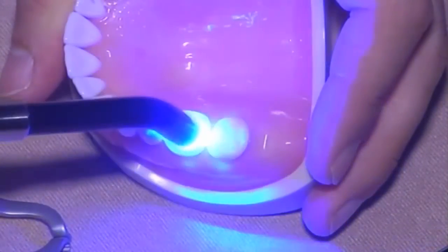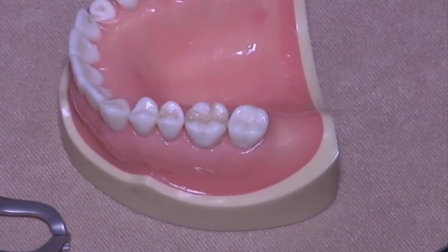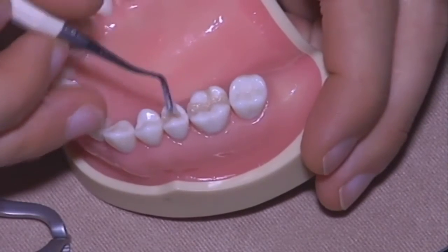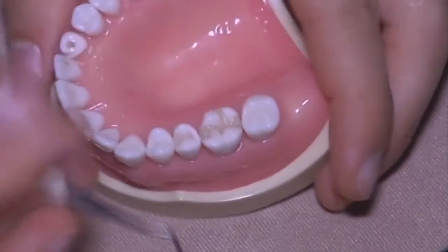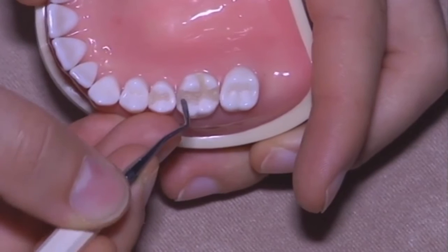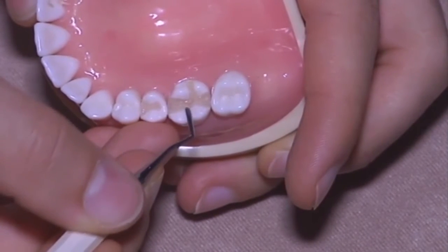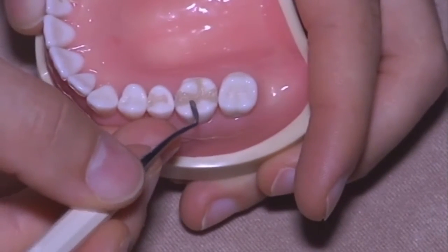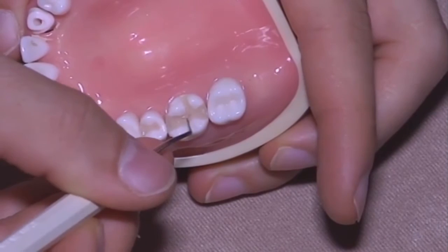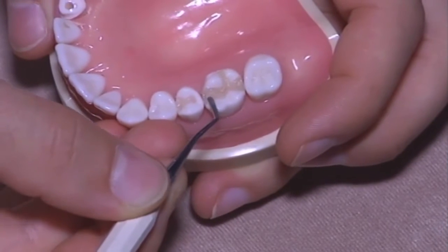That's it. Following the triangular inclination, crest inclination, approaching the composite toward the center of the restoration. Designing the anatomy.